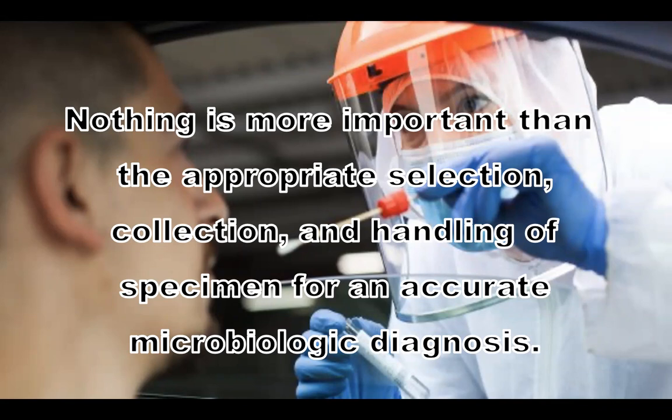Now, after inoculation, we usually incubate it, and then we check out the results the next day. If we need to transport our samples, or if there's a delay, we can refrigerate them or we can grow them on transport media. Okay. Nowadays, we have automated systems that can process all this specimen, particularly blood, in the laboratory, making our lives simpler, our work easier. Okay.